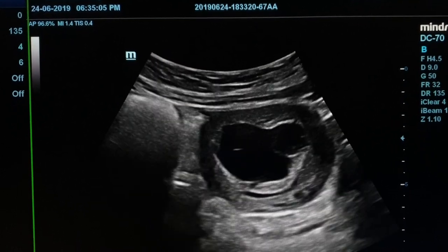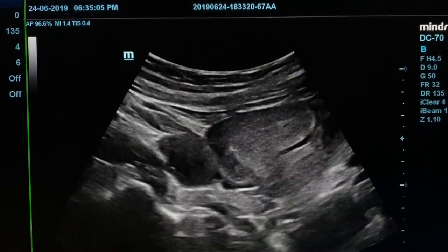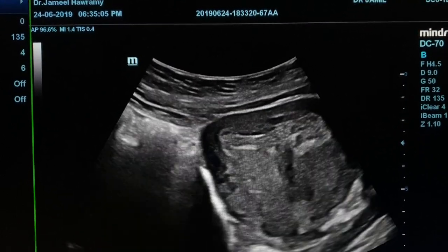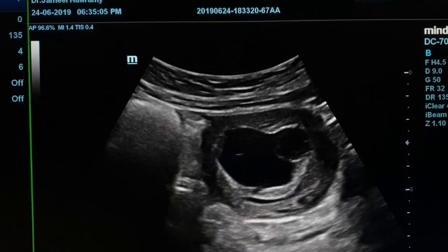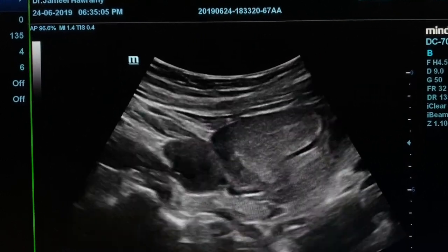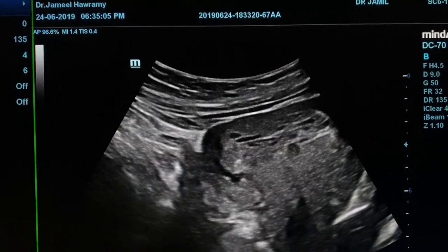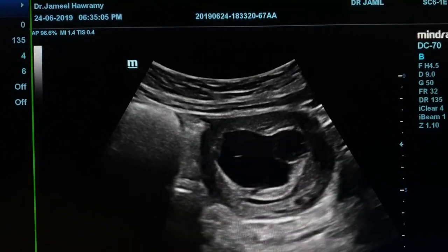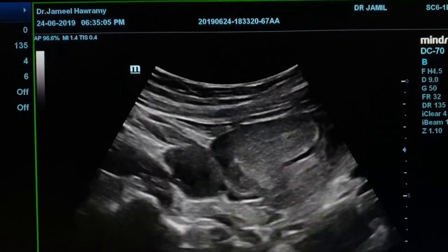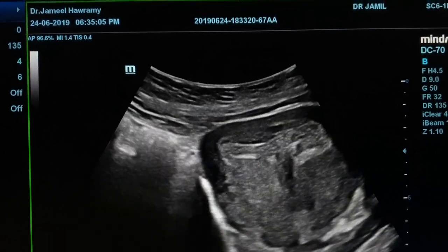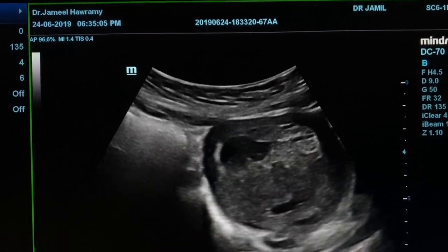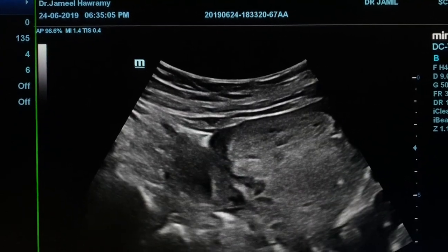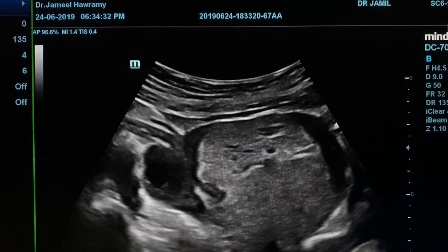Unhealthy looking gestational sac and large yolk sac without embryonic pole. Area of placenta replaced by multiple small cystic areas.